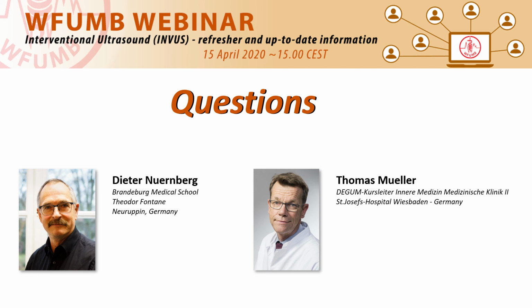Prostate cancer is hardly visible on the ultrasound image, but very well displayed on MRI. So what we do now is we combine MRI imaging of the prostate with a real-time endorectal ultrasound scan of the prostate, and then we can easily locate the suspicious lesion and place the needle in there. This is, in my opinion, the most important clinical application of fusion imaging in interventional ultrasound at this time.